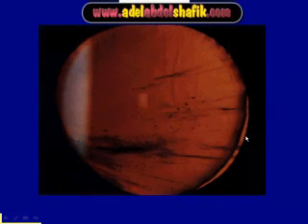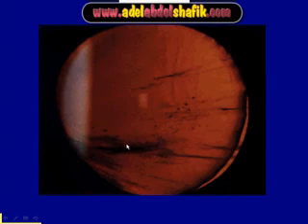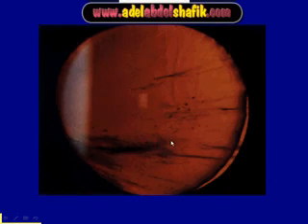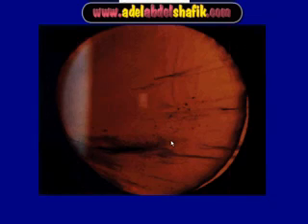This is the pupillary area. You can see here the edge of the lens and some black spots on the back surface of the lens or in the vitreous cavity.